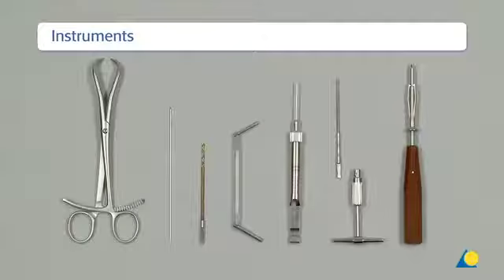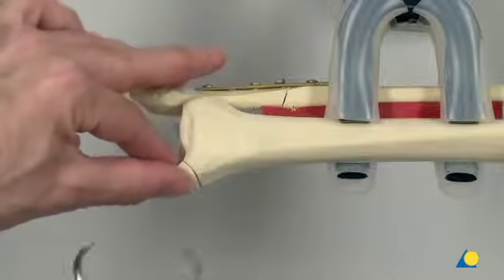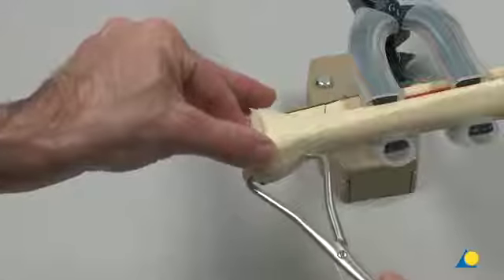The required instruments include the large pointed reduction forceps, the 1.6 mm K-wire, the 2.5 mm drill bit, the 3.5 mm universal drill guide, the depth gauge, the 4.0 mm cancellous tap, and the hexagonal screwdriver with holding sleeve. The fracture is reduced anatomically, clinically using pointed reduction forceps.